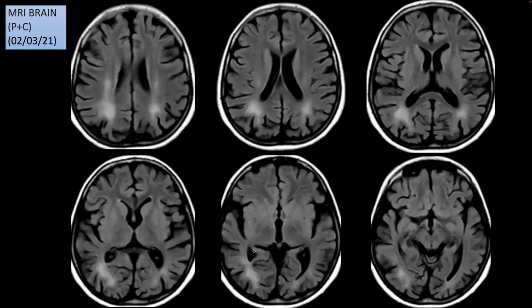Okay. This was the MRI. Some degree of cerebral atrophy, parietal volume loss, but again, changes of bilateral hyperintensities along the posterior periventricular, deep extending up to the subcortical white matter. In the centrum semiovale, the parietal lobes, the temporal lobes, and occipital lobes. So predominant white matter changes in the mid and posterior cerebral hemispheres, over a background of volume loss in the supratentorial brain parenchyma.